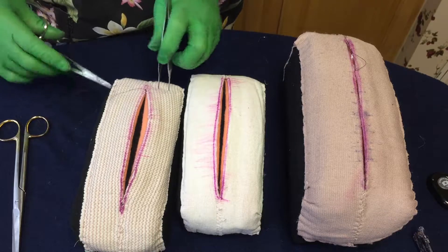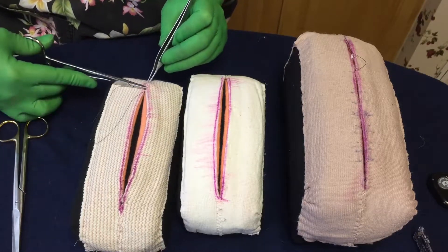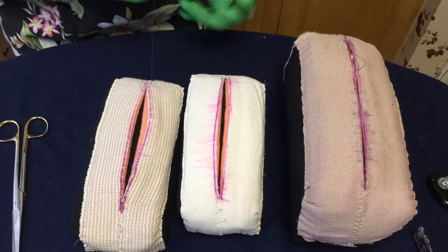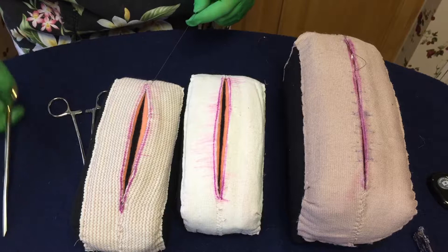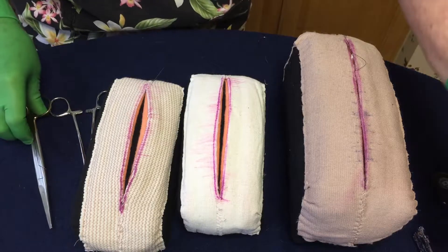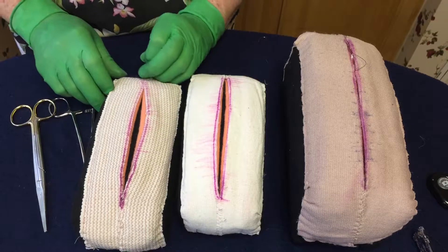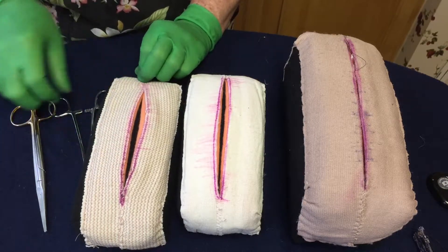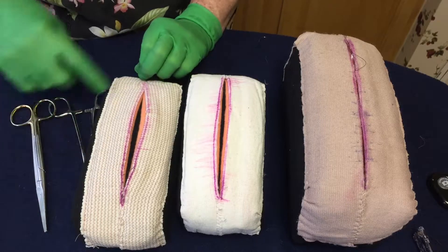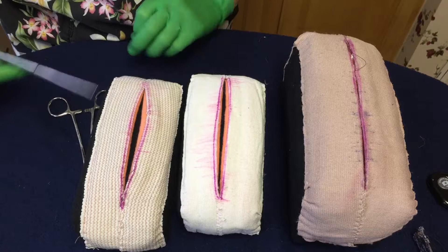Sometimes if the corner's not meeting — and I've mentioned this in some of the videos — if there's a little bit of a gap there, just leave a little suture there and hold it until you either get your skin glue on or your steri-strips on. Once you get those on and the corner's meeting nicely, then you can go ahead and cut it off.